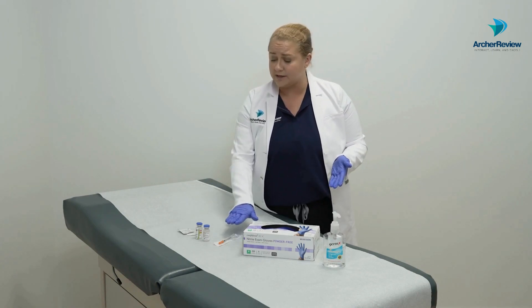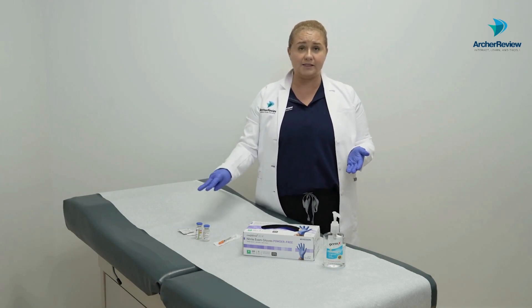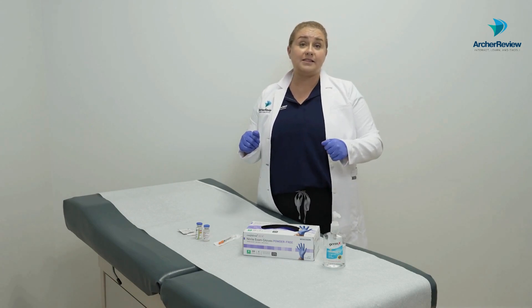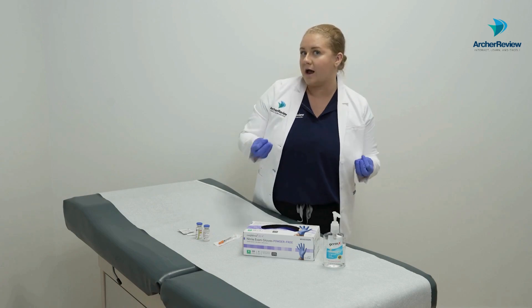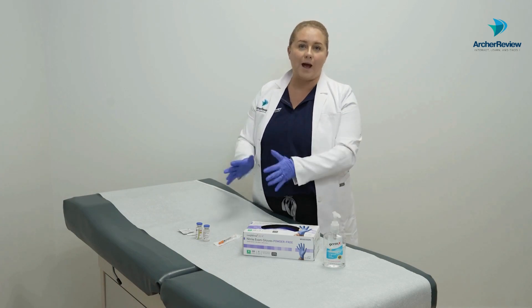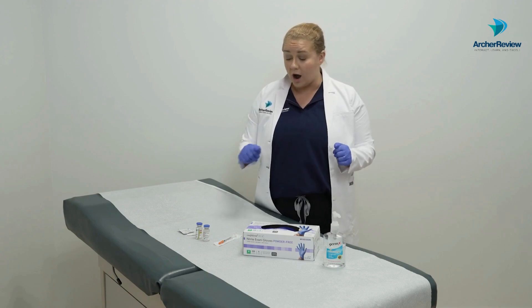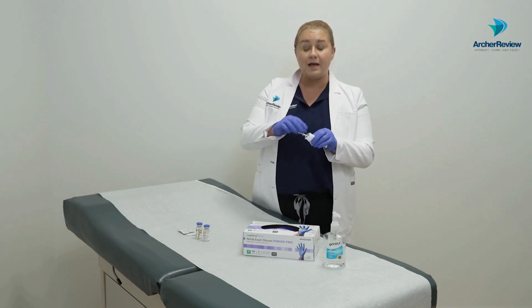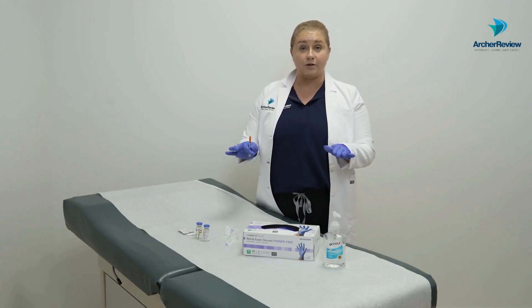Once we've got our clean gloves on, we'll check that we have all our supplies: our insulin syringe, both vials of insulin, and two alcohol prep pads. As I've looked at my orders, I have to administer two units of NPH and five units of my rapid-acting insulin aspart. We're going to start by taking our insulin syringe and injecting the appropriate amount of air into each vial.